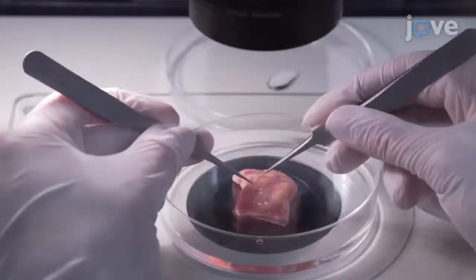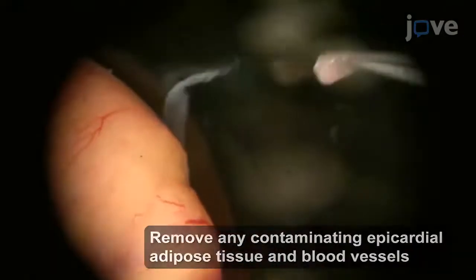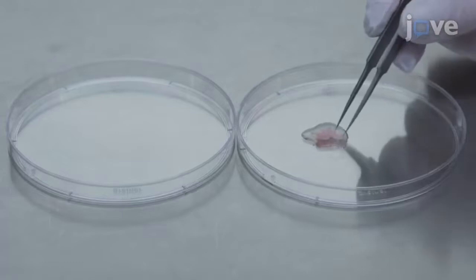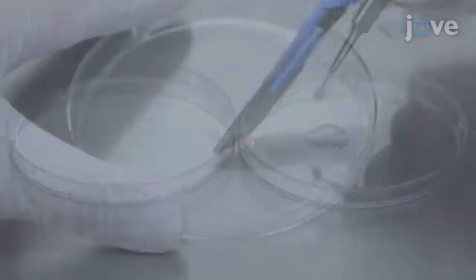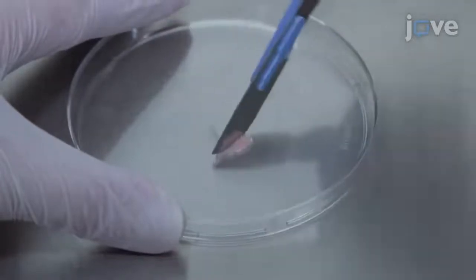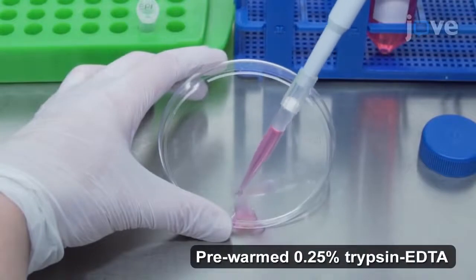Under a stereomicroscope, use forceps to carefully remove the epicardial layer. Next, collect the pieces of epicardial tissue in the lid and use a scalpel to cut them into 0.5-3-millimeter pieces. Add 1 milliliter of trypsin to the tissue pieces.